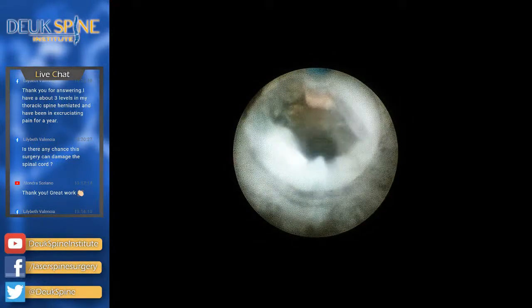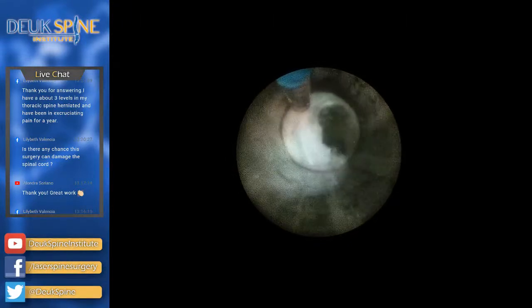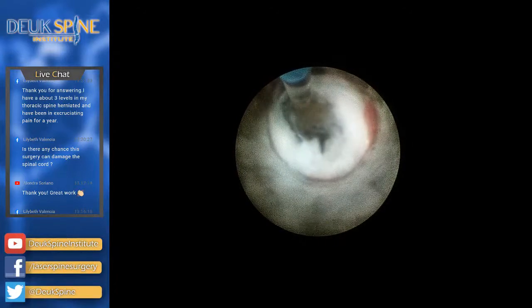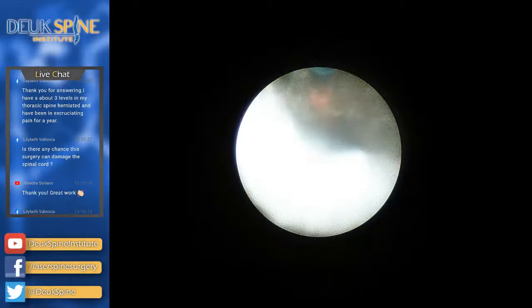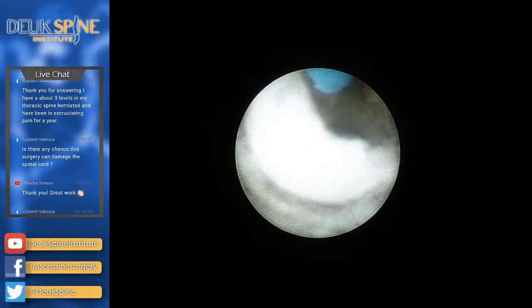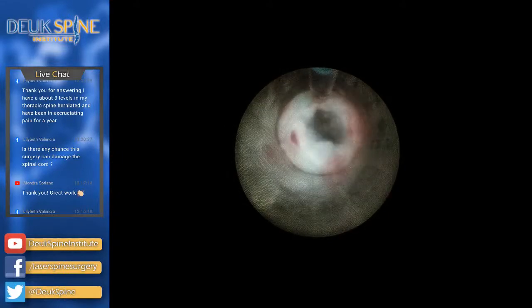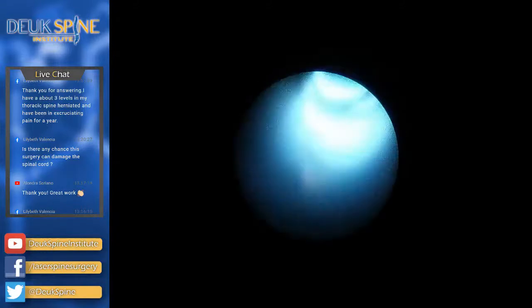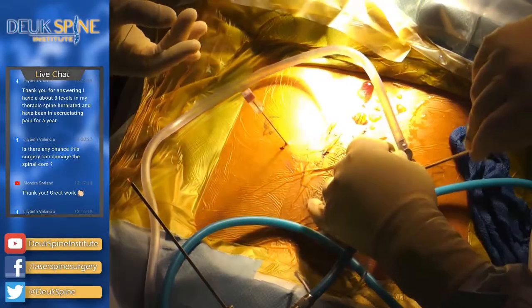All right, that's it. We're done. We're just outside the disc now. You can see the fat in the foramen. Right there, some blood vessels and stuff. So we're done. All right. Just get this. So grungy. Yeah, we're outside the disc now. Now we've done everything I can do. I think it will be a good result. And we're going to go to the other side.